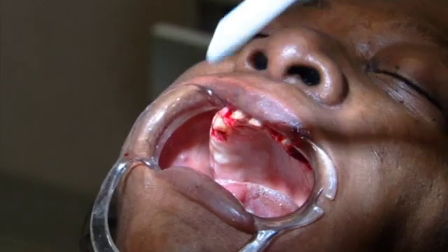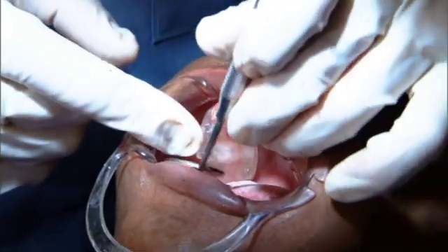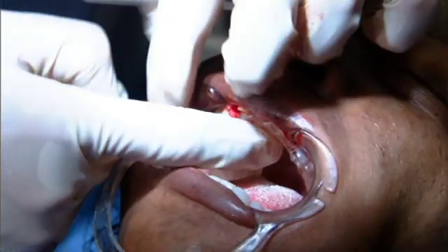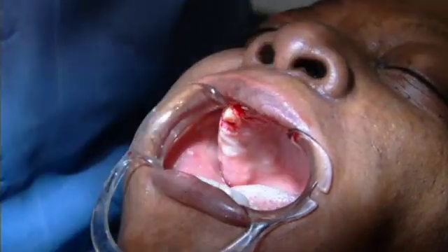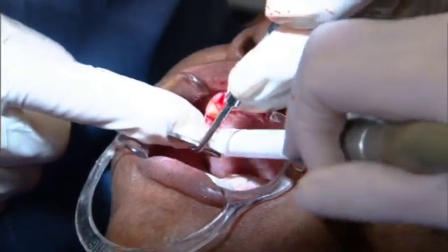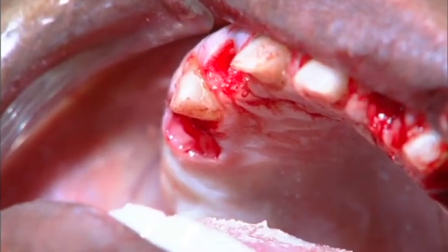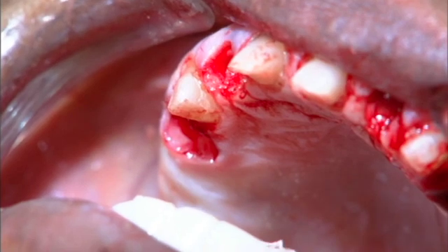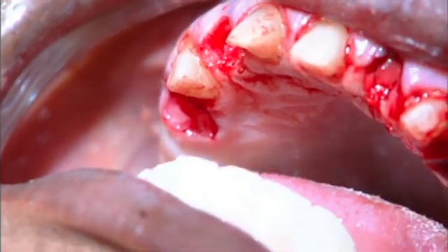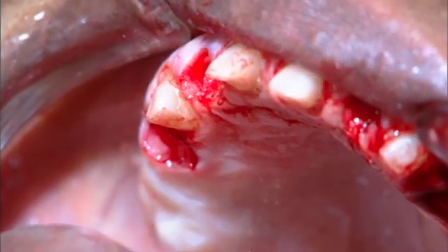I've made my pilot holes, and what I'd like to do is take my little surgical stent that fits in her mouth and make sure that my alignment is going to be exactly the way I want it, and we're dead on. This is just a clear duplicate of the temporary partial. We've got our osteotomy drilled. I'm going to make a couple of little measurements. I know that the crest of the bone where I'm working is right there. It's 3 millimeters from the soft tissue, so where I'd use a 13 millimeter drill, I have to add 3 millimeters to it, so I'm really going to use a 16 millimeter drill. So I can just jump up one size in the surgical kit.